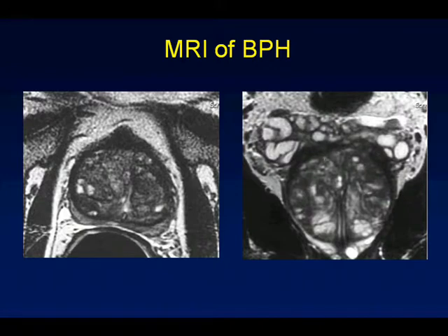BPH can be a bit of a problem because you can kind of compress the peripheral zone. It does make it a little bit harder to interpret.